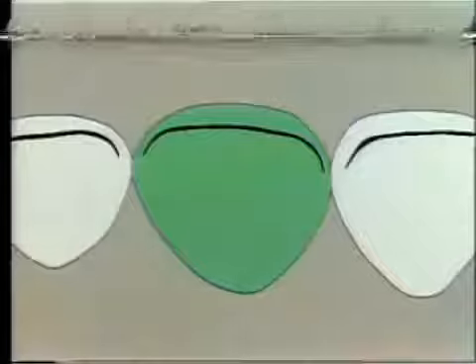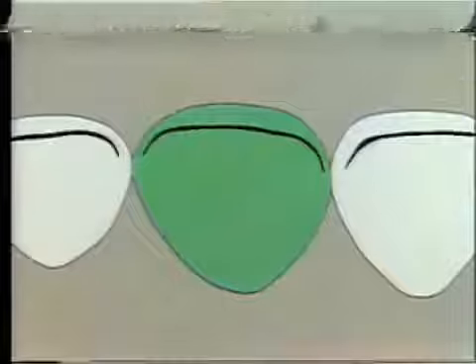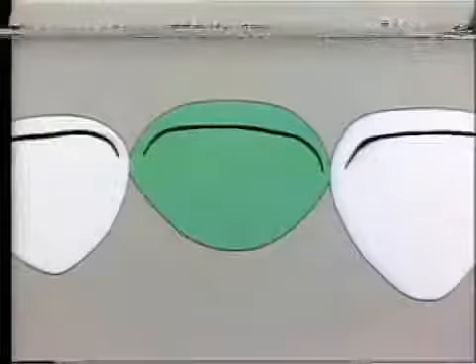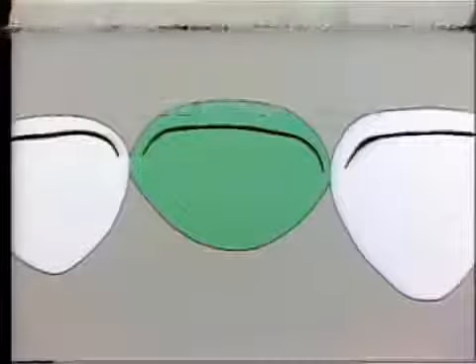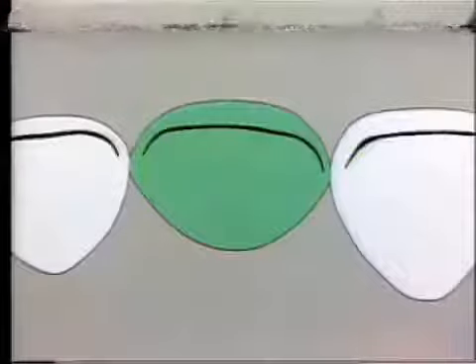This diagram shows a horizontal cross-section through a maxillary central incisor and shows the normal anatomical form of that tooth. Modification is made to this to convert it into a Pontic form by adjusting the lingual surface of this tooth. The lingual embrasures are opened as shown in this fade-in on the screen. This opens the interproximal embrasures on the lingual surface, and gives good access to the underlying tissue, to retainer margins and the contact areas.